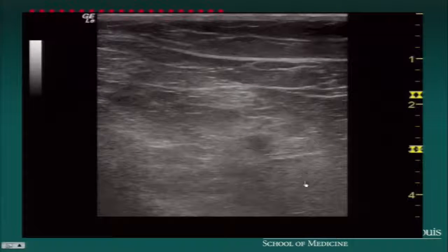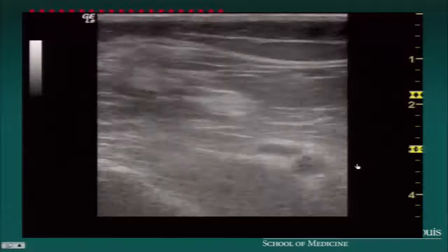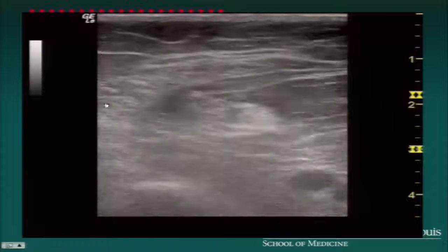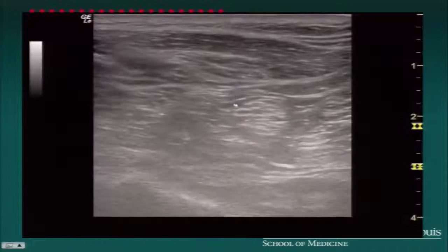This is a video clip I'm going to show you. We're going to start out with the popliteal artery, and you can see the tibial component, and you'll see that we're going to trace this nerve proximally. You'll see the junction of the tibial and peroneal components here. This is obviously lateral and this is medial. So now we have a nice isolated nerve right here.